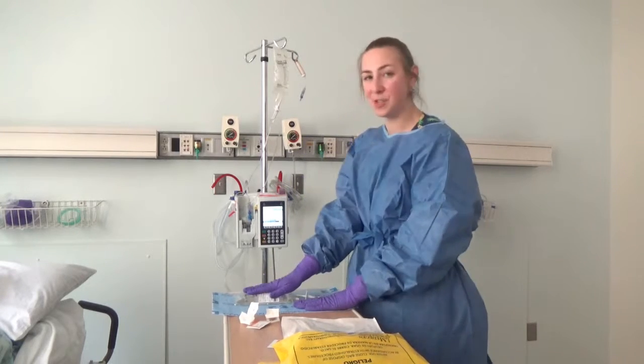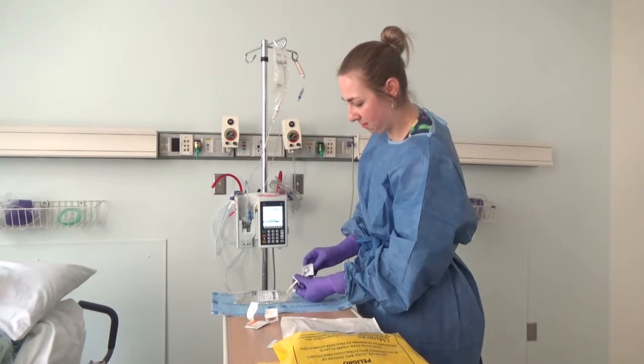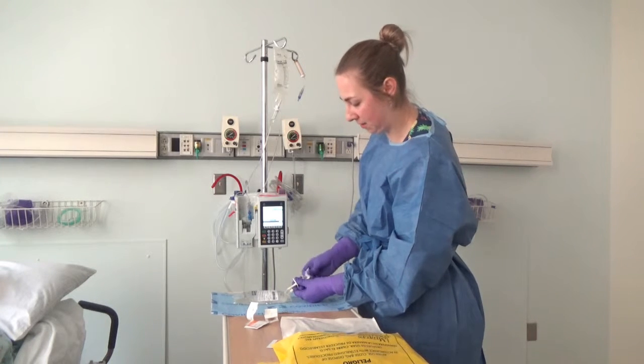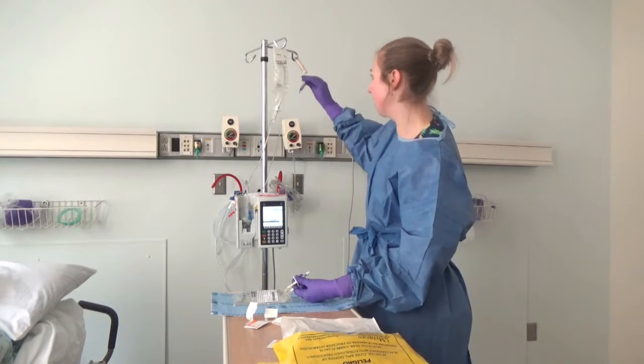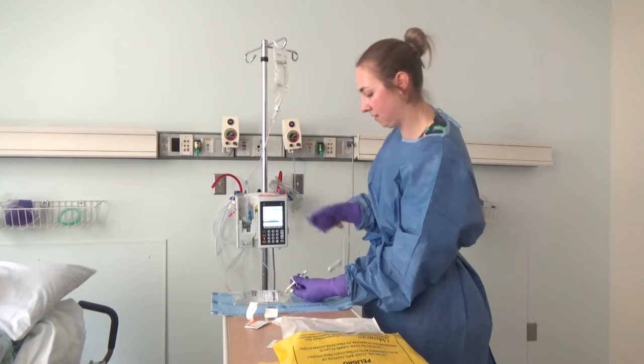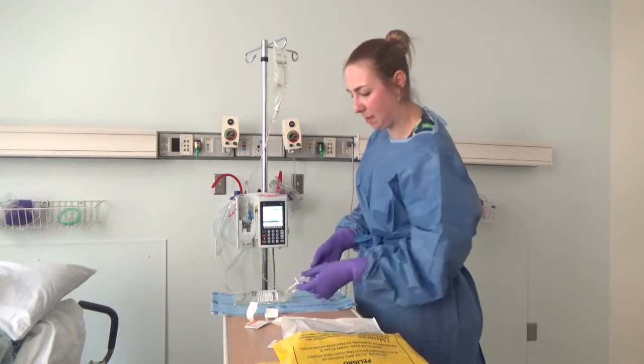I'll take my next drug, etoposide, laying it on my chemo mat, clean the hub, and I'll take my secondary chemo tubing, remove that cap, and attach my chemo bag.